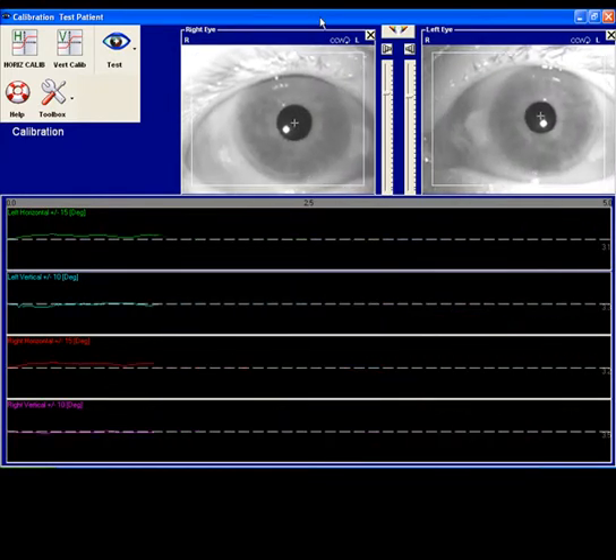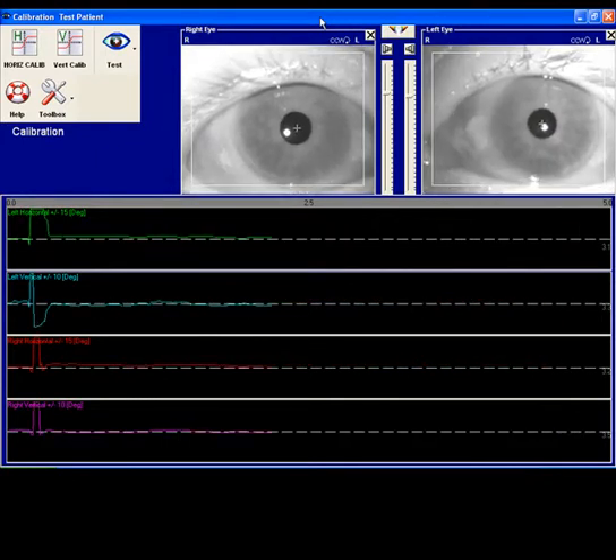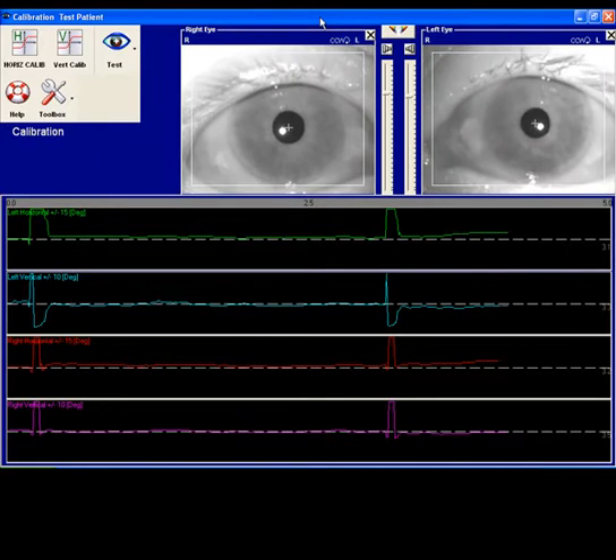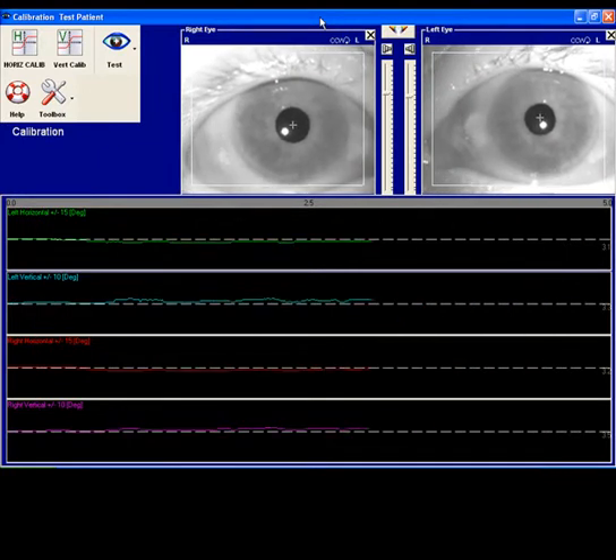In calibration, the patient sits 39 inches away from the fixation target. The fixation target can come in three different models: a digital light bar, an LCD projector, or a flat screen TV. The patient holds her head very steady for this portion of the testing.